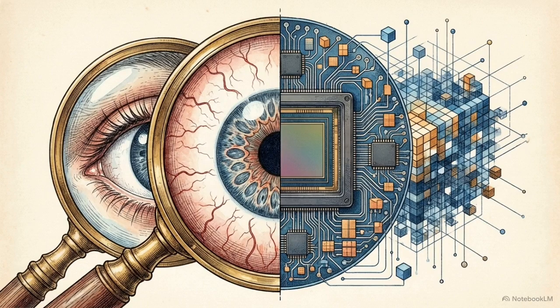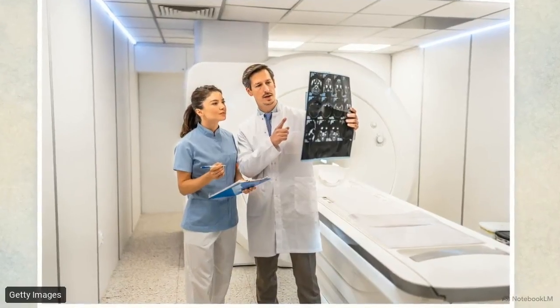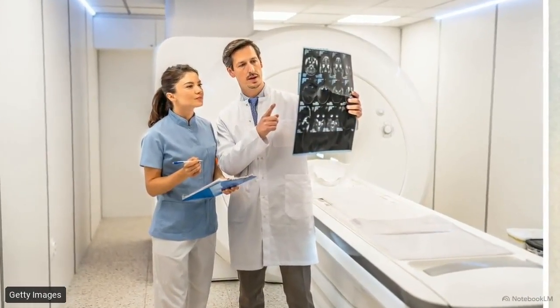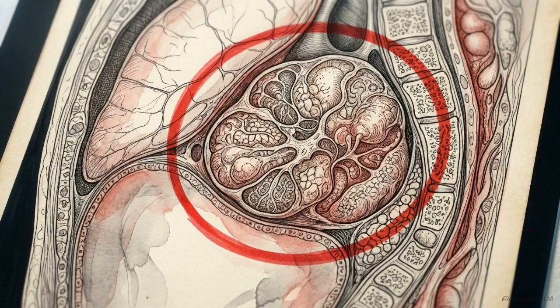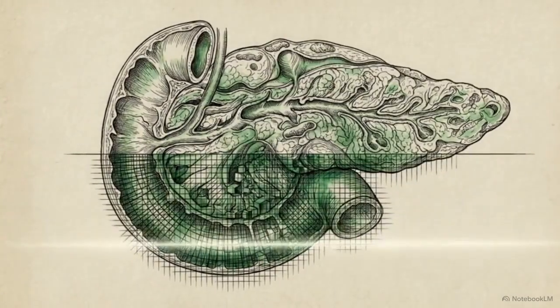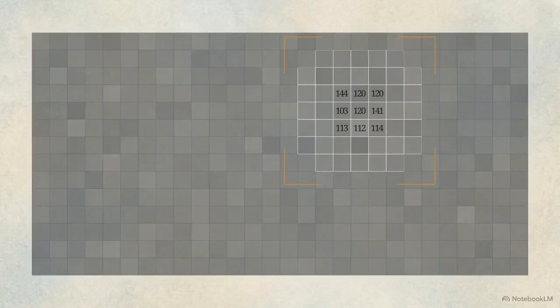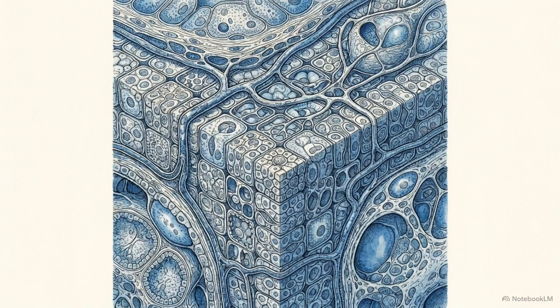If a human specialist and an algorithm act as a digital magnifying glass, locating microscopic tumors that a doctor simply missed, that is incorrect. The human visual cortex evolved to recognize macroscopic patterns and defined boundaries. When doctors evaluate medical imaging, they are inherently searching for structural anomalies, a mass, a lesion, or an obstructed duct. RadMod succeeds by bypassing macroscopic anatomy and evaluating the scan as a high-density matrix of raw mathematical data. The algorithm scans for microscopic shifts in the texture and microarchitecture of the pancreatic tissue. The system's predictive power resides within the CT scan's underlying identity as a vast computational grid.